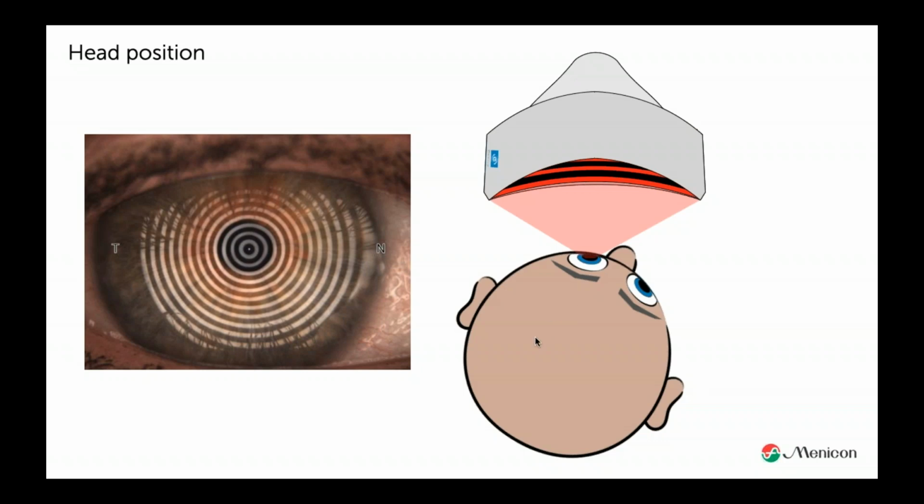So make sure that you get the head position right. And sometimes you create strange situations. If the patient is with the chin on the rest, you have to put them in different strange positions. But again, the patient wants good help. The patient wants good lenses. So we have to make that effort to create a situation where we can calculate with the right information.